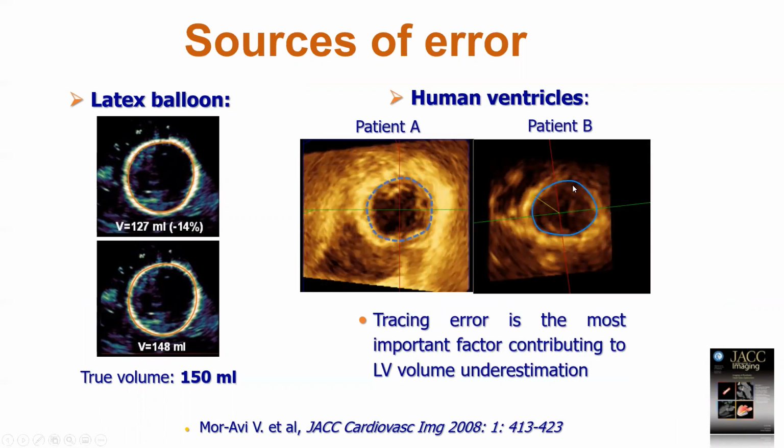So Victor Moravi from the University of Chicago has nicely demonstrated the sources of error using imaging of some latex balloon phantoms.